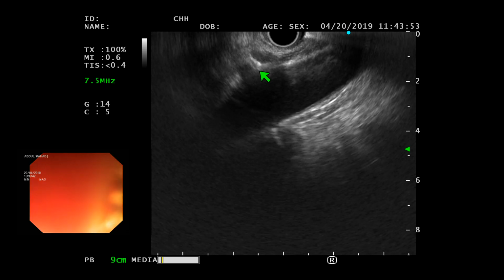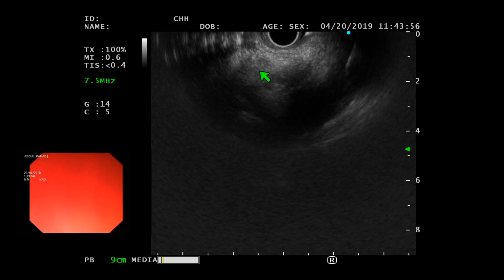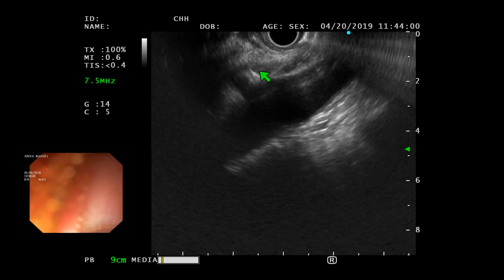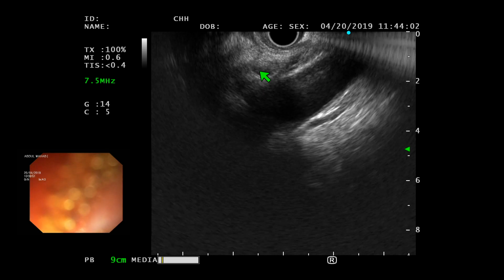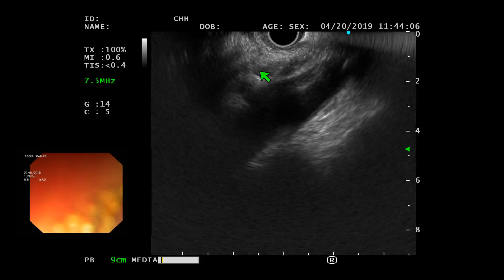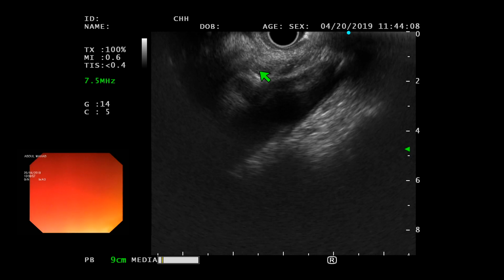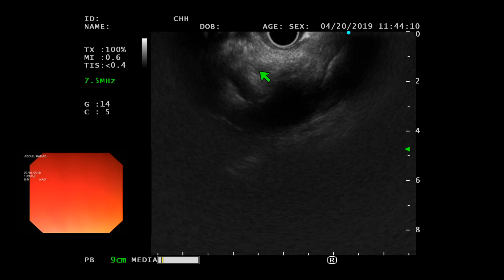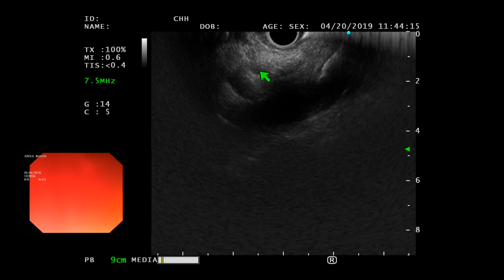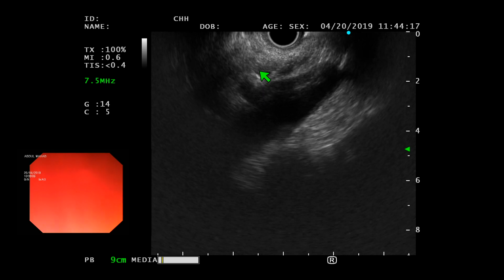So this would be with steroids and local anesthetic. I'm using 40 milligrams of Kenacort and bupivacaine. You have that spray needle, right? Actually, I use a standard FNA needle. Which one do you use?